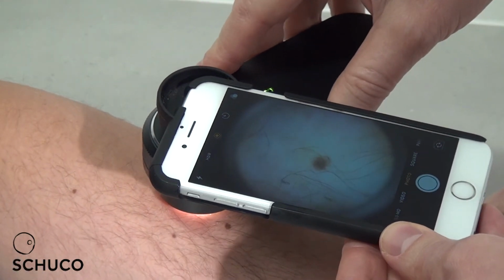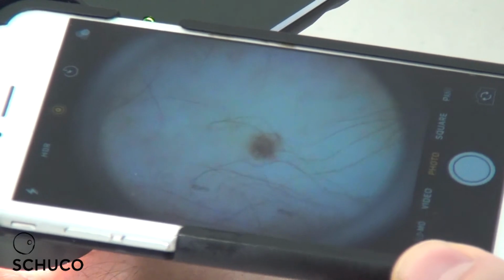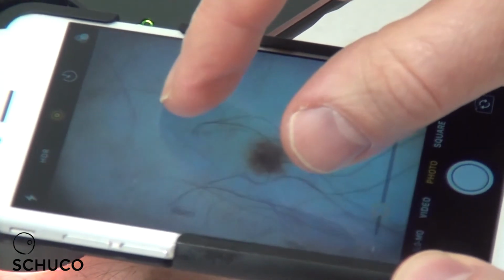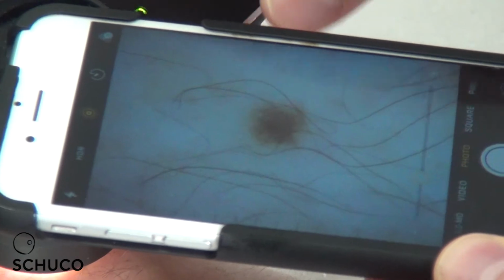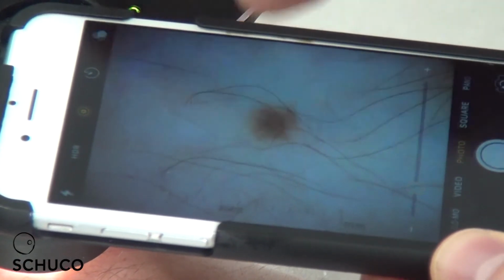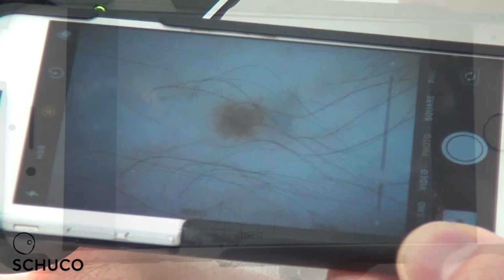You can then rotate the dermatoscope and try, if you can, to get the graticule, which is the measurements along the long axis, and then you can just gently zoom in onto the lesion, obviously trying to reduce the amount of hairs in the image. And then when you're happy with the image, you just press the button to take the photo.